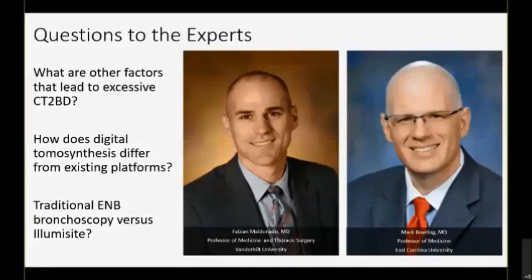Yes. Okay, good. I was going to say that the radiolucent bed is a non-issue in my view. We've been using fluoroscopic navigation for a while, with a regular OR bed and with the fancy bed, and I really haven't seen much of a difference. We don't have the experience that Mark has with Illumisite, with the continuous guidance. I personally think the big step forward with this technology is the ability to recalibrate your navigation, see the lesion, and be able to correct your plan.